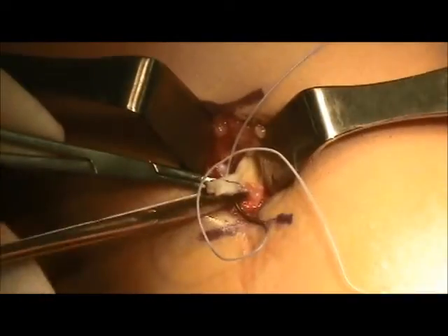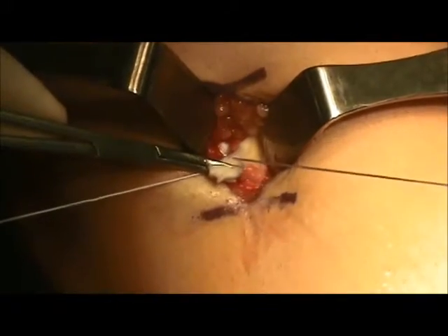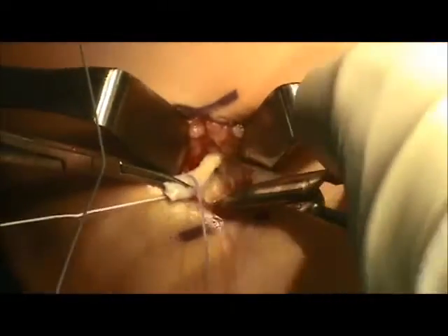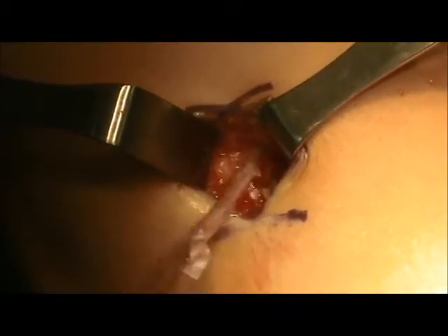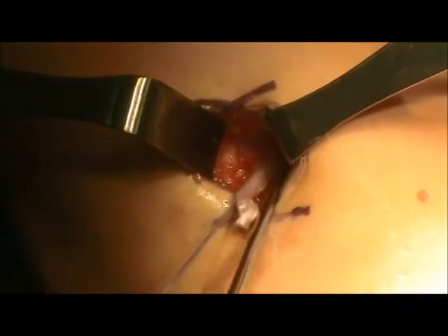With control of the gracilis tendon with a clamp, the tendon is sutured with a number one non-absorbable suture. Once control is obtained of the graft, more extensive dissection with release of the soft tissue attachments can be performed. The suturing is then completed in a whip-stitch fashion, and then blunt dissection is used to make sure that all soft tissue is freed from the tendon.